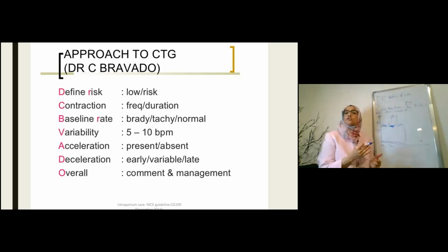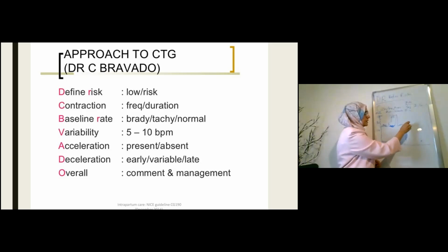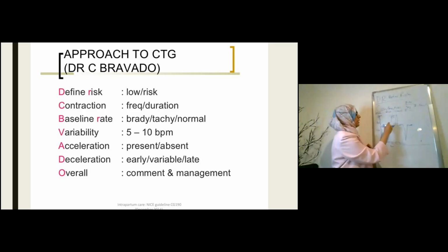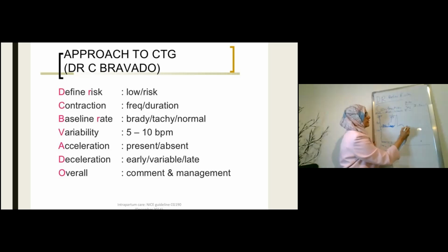But then many physiological changes take place, and it kind of comes up. I say, no, I must keep going. I must keep going. Then it starts to really conserve itself. And the happy variability that you saw here gets less and less and less. So even when it comes down, this line becomes really a straight line.